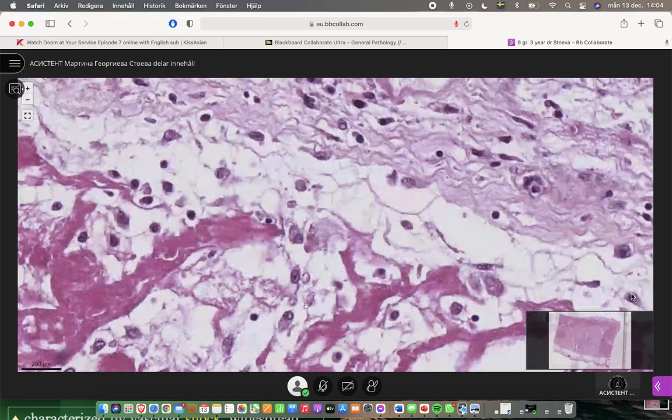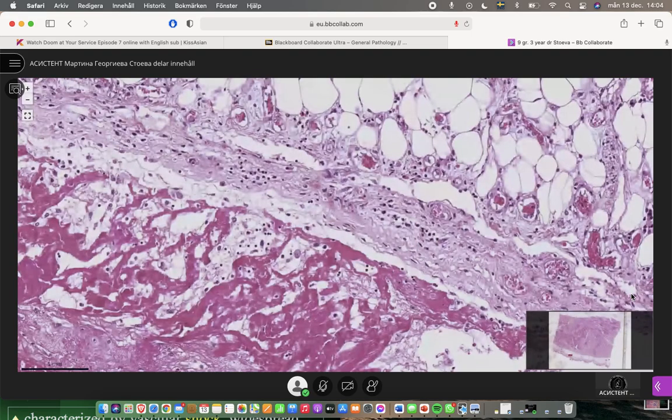But still, if you get the slide during the exam, at least you can show that you know how the different types of inflammatory cells look like, and say that as a type of acute inflammation, here you expect to see more neutrophils than mononuclear cells, but here perhaps the inflammation is long lasting, and that's why we already have enough mononuclear cells as well.